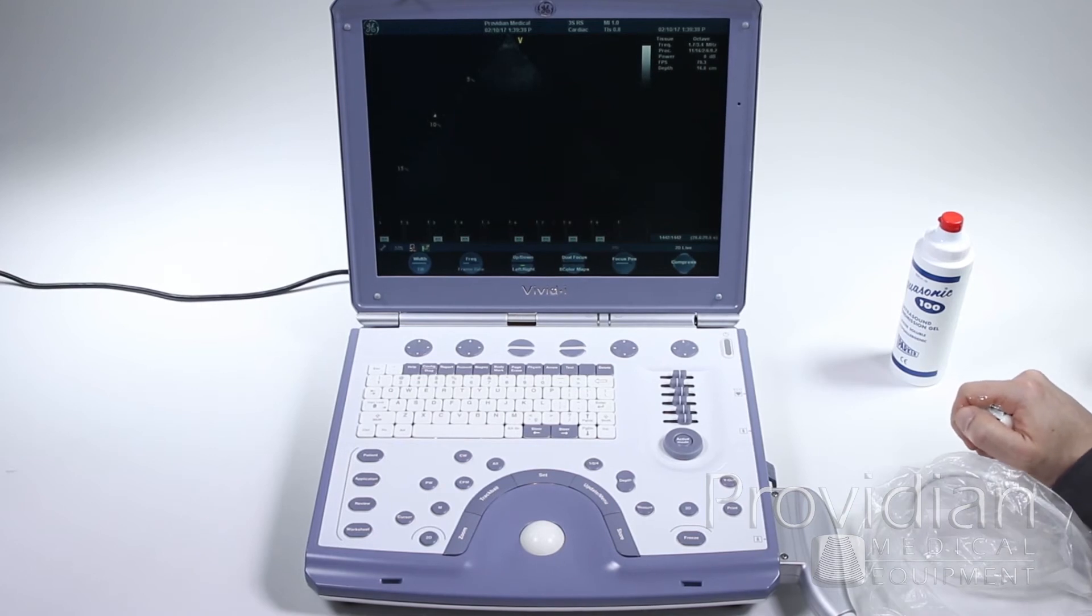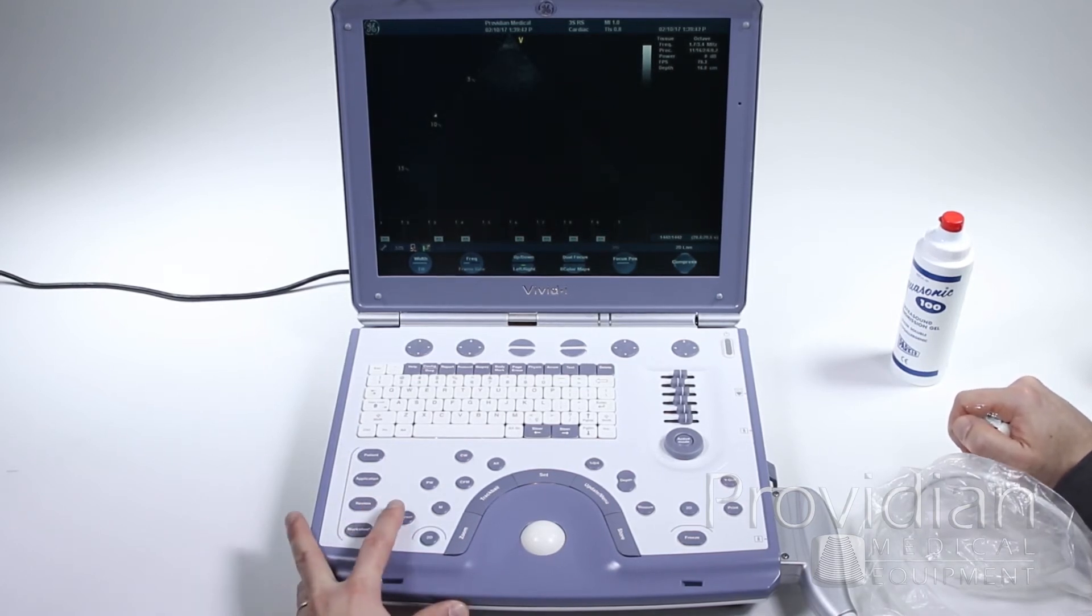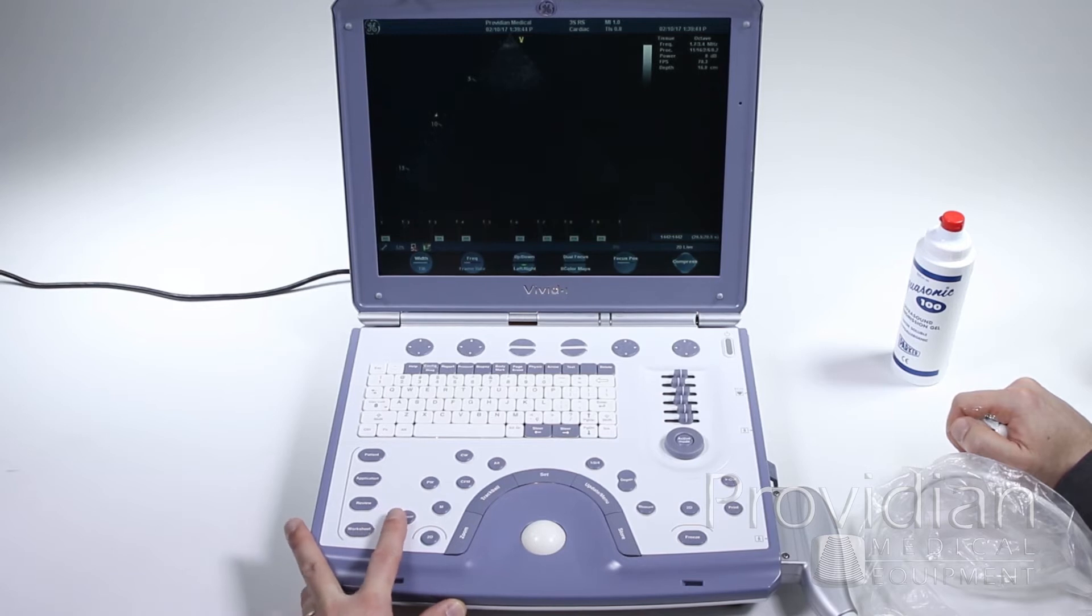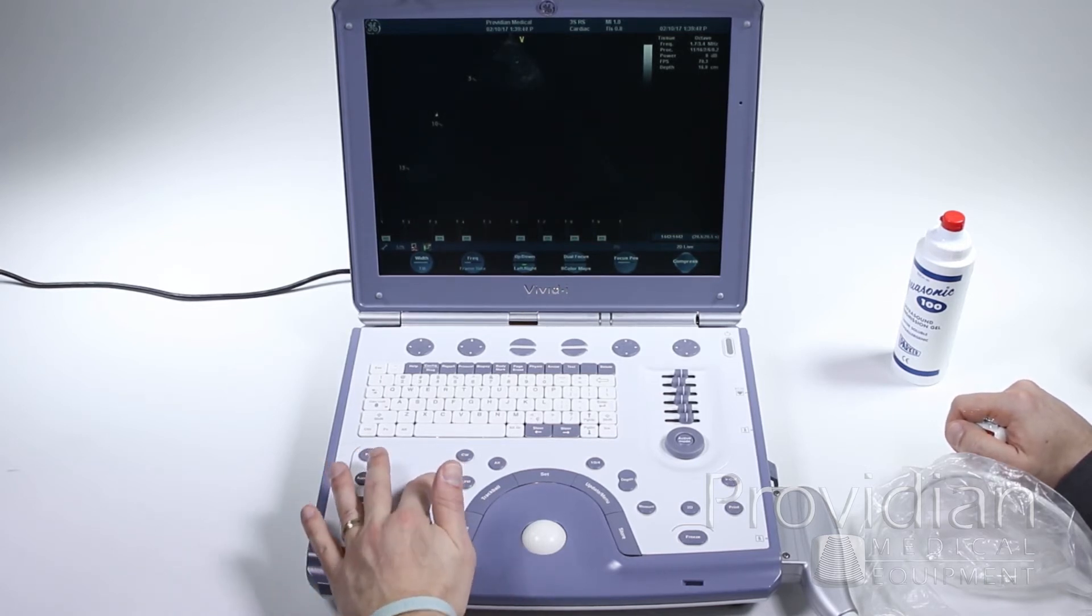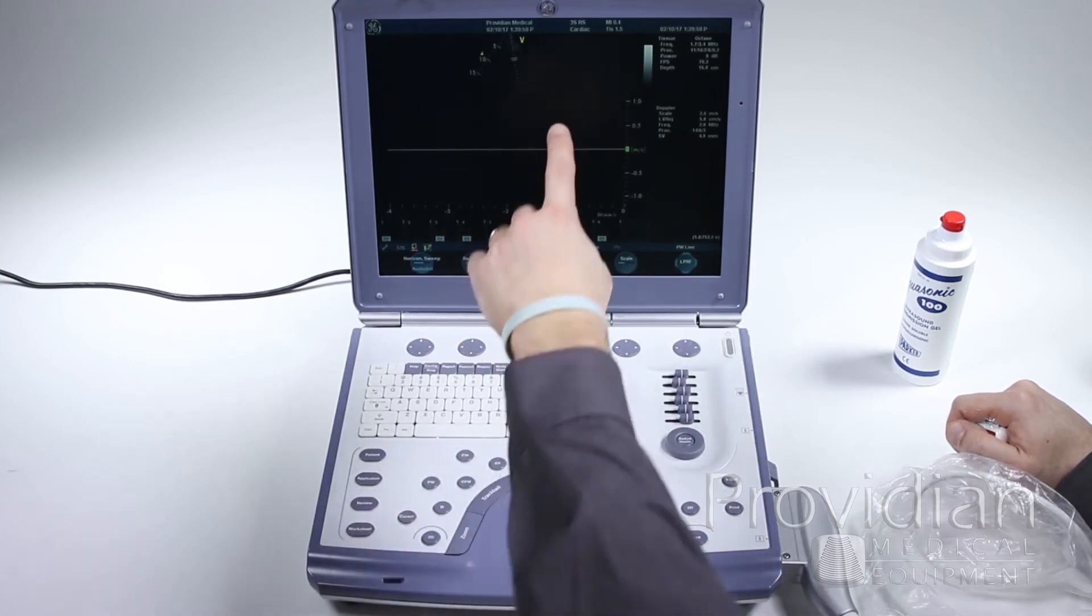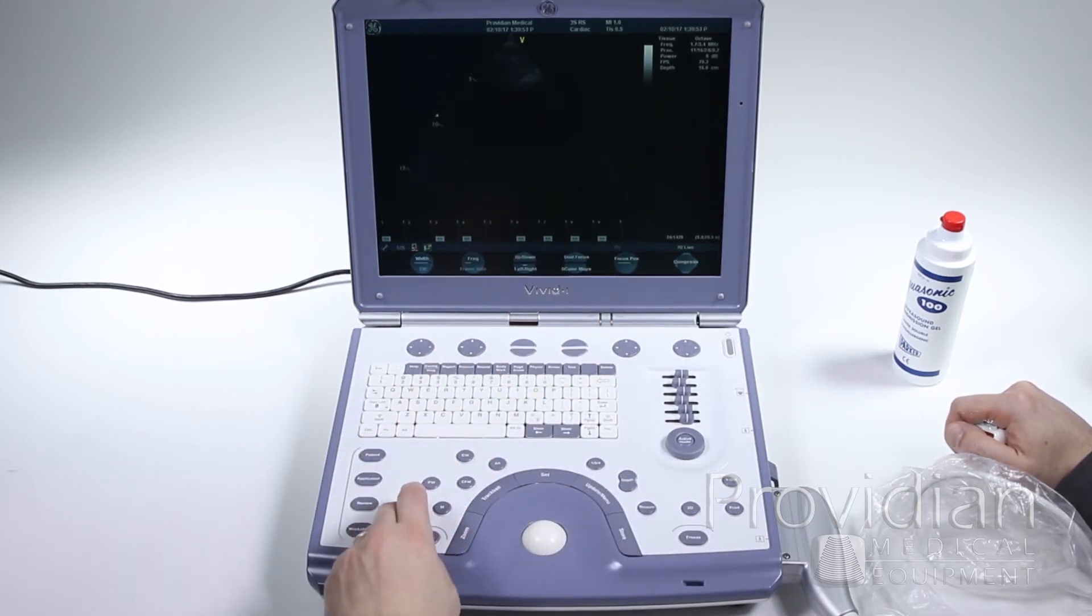Moving on to pulse wave. We'll select that cursor again because this allows us also to adjust our angle a whole lot easier. If we go directly into pulse wave, adjusting the angle of our gate is a lot more difficult, so what we want to do is first hit cursor.